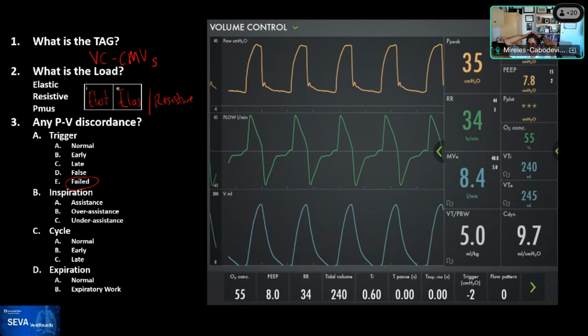Yes, exactly, Steve. Yes, absolutely. You're right on. I think that there is a component of auto PEEP, and that's not letting the patient trigger. And so our team caring for this patient, I mean, there's no doubt that this patient is extreme. I mean, it has a compliance in the gutter, very low tidal volumes, very fast respiratory rate, high oxygen levels.